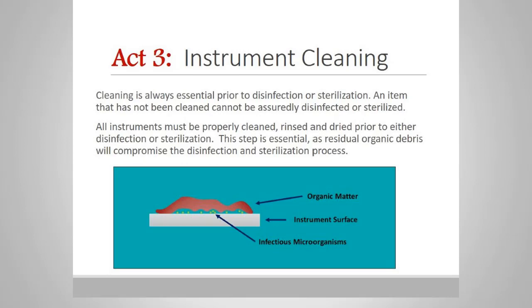Now, instrument cleaning is important because cleaning is essential prior to disinfection and sterilization. If you have organic debris on your instrument, and you can see in this image there's organic debris, the instrument surface can trap infectious microorganisms. We cannot guarantee the sterility of this instrument if it goes through the autoclave.